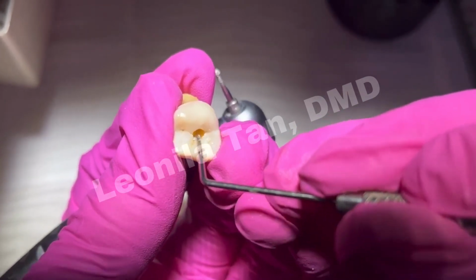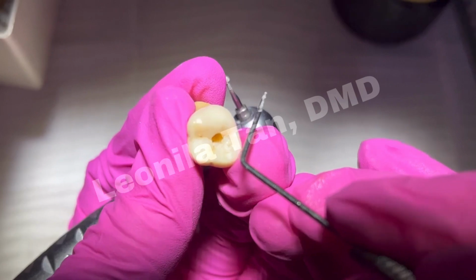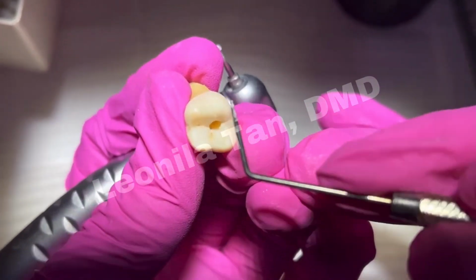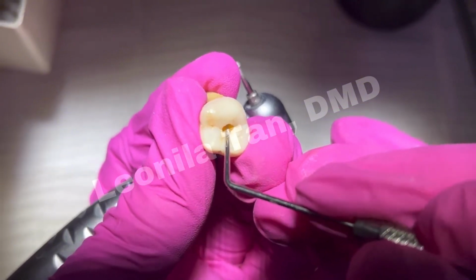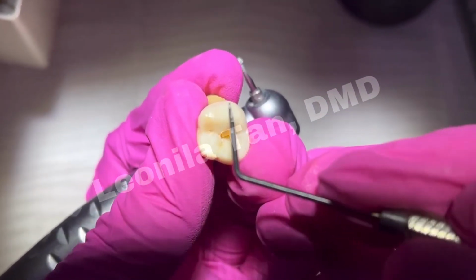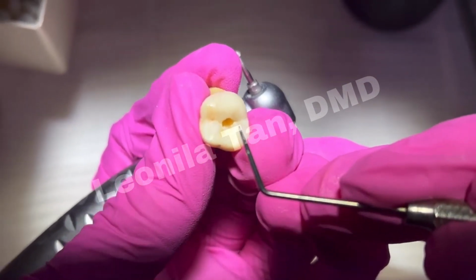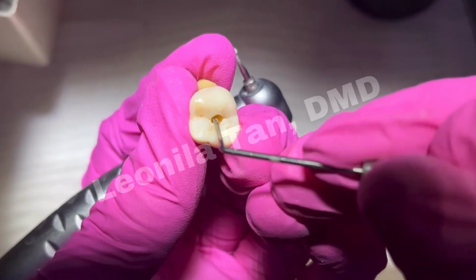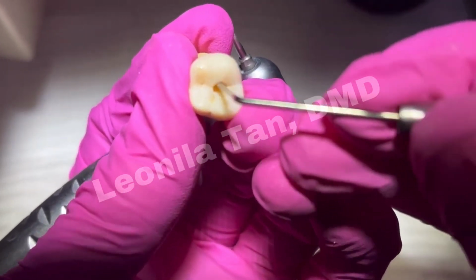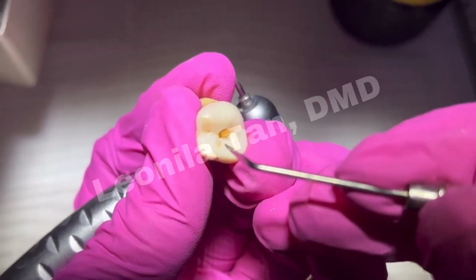So if somehow you feel that it's going in that direction to the mesial or going to the distal, then you need to reorient your burr. Like this one, it's still moving towards the palatal area and I'm avoiding the marginal ridge, and I feel that I am very near already to locating that drop or the entry.